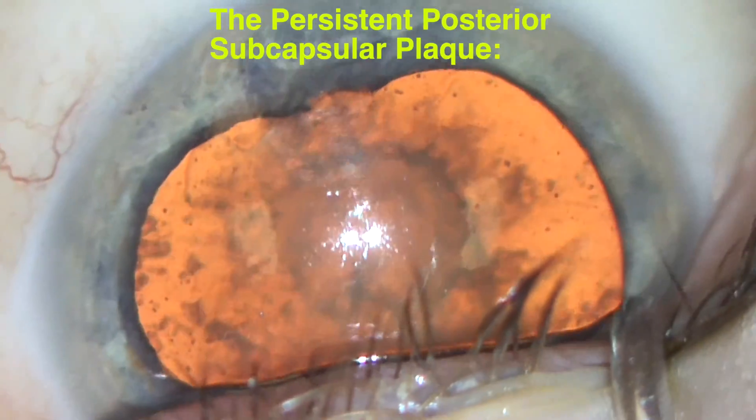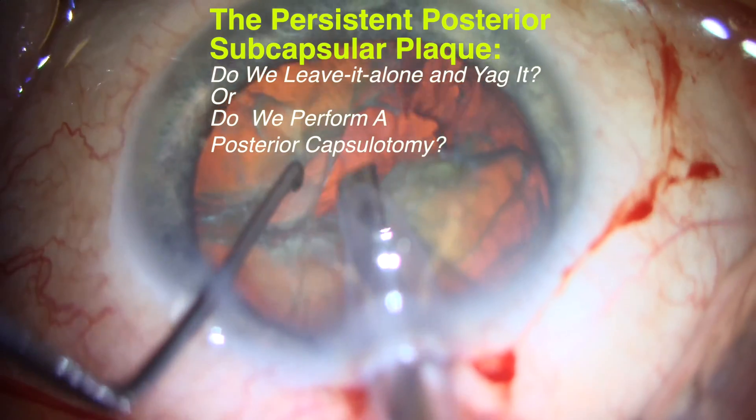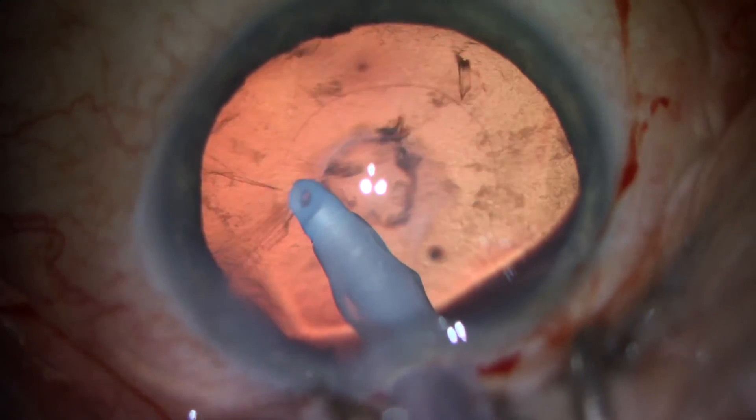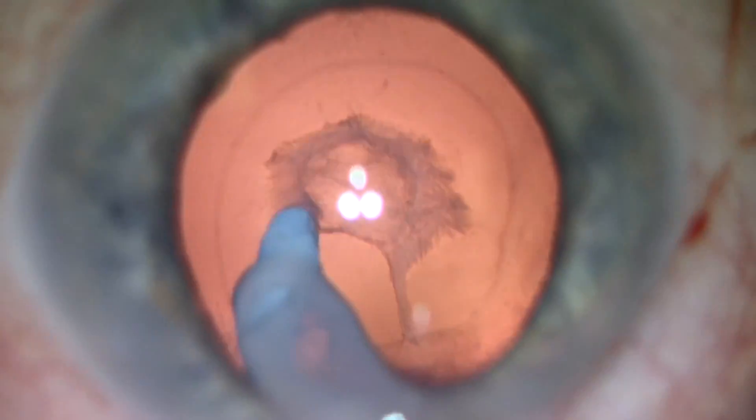This is a not uncommon situation encountered with cataract surgery: the adherent posterior subcapsular plaque. Despite our efforts to polish the plaque from the posterior capsule, it remains adherent.